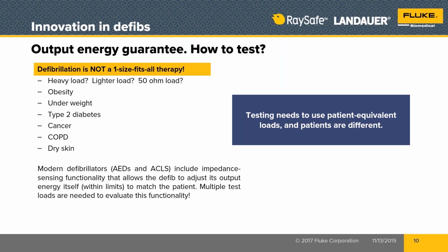In any defibrillator, the energy level that they are charging up to, whether set by a dial setting by the doctor or the nurse, or whether it's an AED that already has a setting it's supposed to deliver, that value should be what's delivered to the patient at the paddles or the pads.